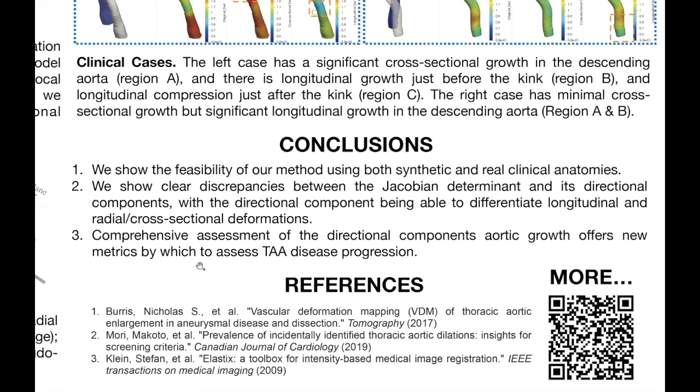In conclusion, we have demonstrated our method's ability to isolate measurements of cross-sectional and longitudinal aortic growth in both synthetic experiments and real clinical cases. We identified clear separation of regions with longitudinal and cross-sectional growth in clinical cases in a way that has not been previously described. We hope that our method can offer new metrics to assess aortic aneurysm progression and improve understanding of this disease.